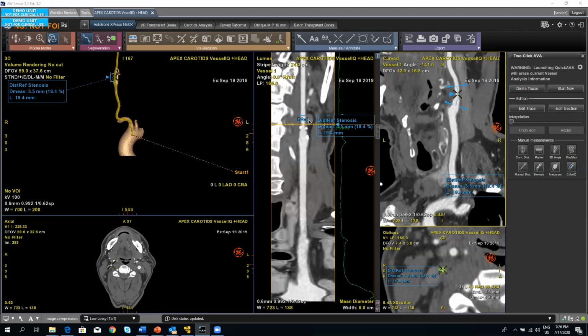So we're gonna have these 2 reference points. Then we have the mean of this diameter, 18.4, okay? So the same way that we did for the abdominal aorta study, we can also do the color ID.